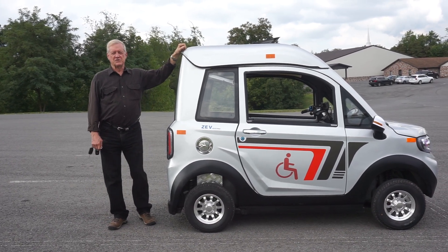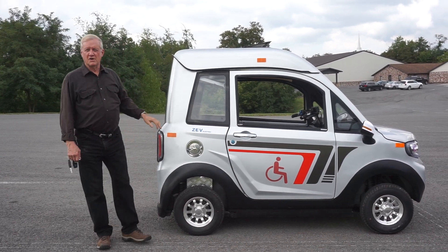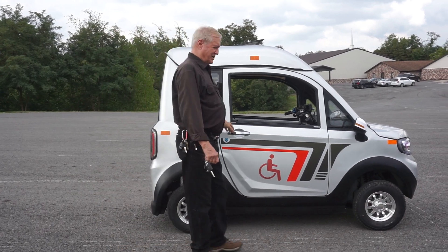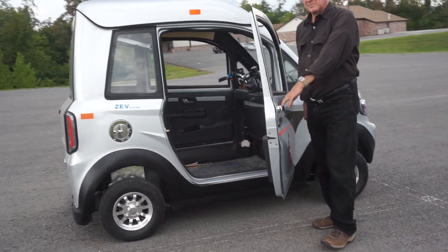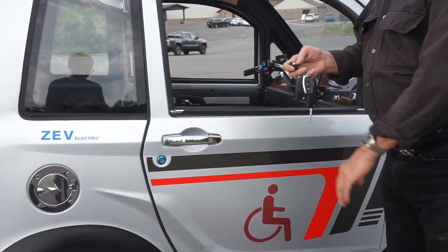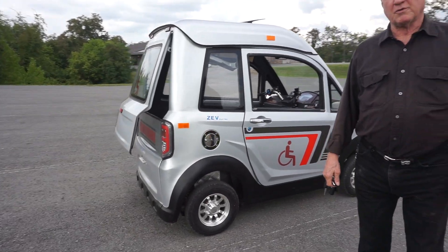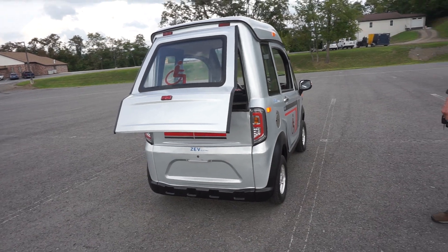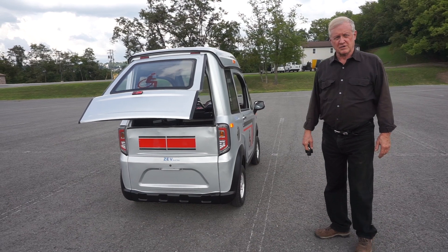Hi, I'm Darius from ZEV Electric. This is our newest vehicle, a wheelchair or mobility vehicle. What makes this vehicle unique is it doesn't have any seats in it. As you can see by watching the tail end, it's made for a power scooter or a wheelchair to be driven right up into the back end of the vehicle, and then that becomes the seat to control the vehicle from.